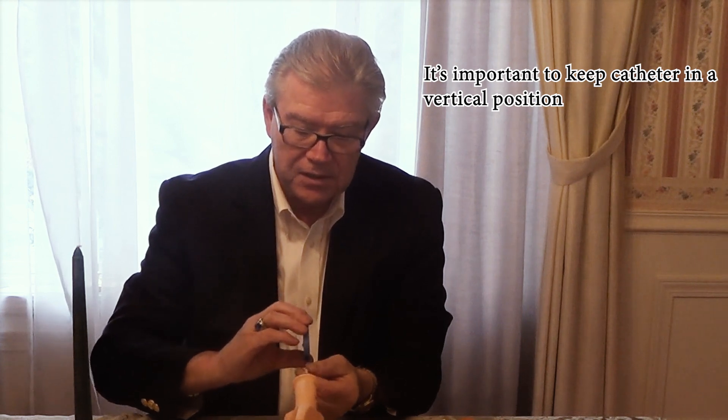Very simple to use. It takes a little bit of dexterity to learn how to do this, but once you get it down, you're going to love it. That is the Compact Cath Classic design. Once you pull it out, you can go ahead and wind the catheter back into the casing itself, then dispose of it — just put it into the package and throw it away.